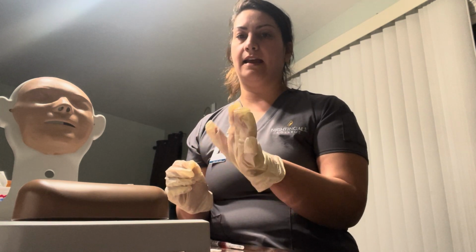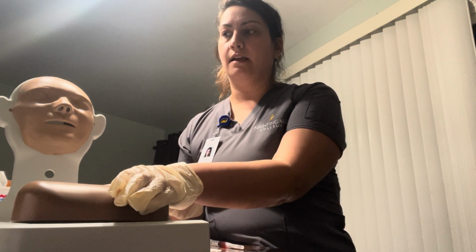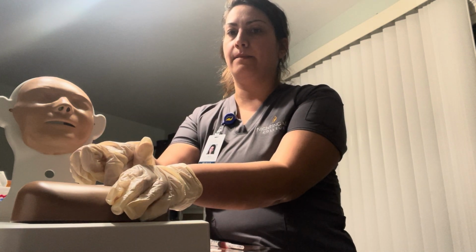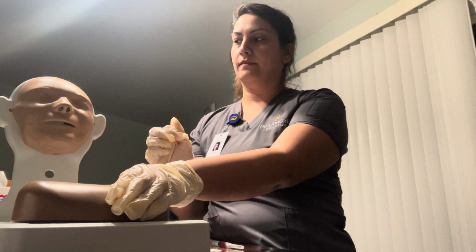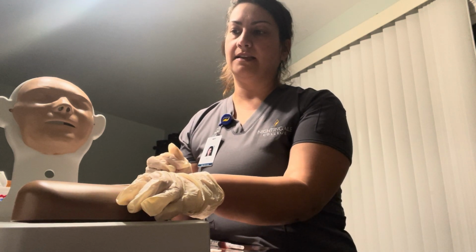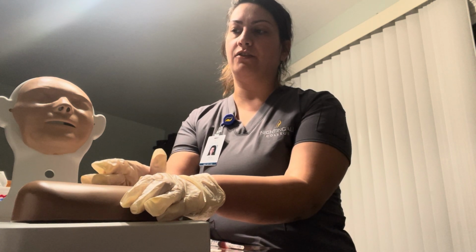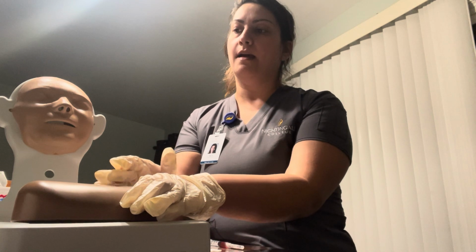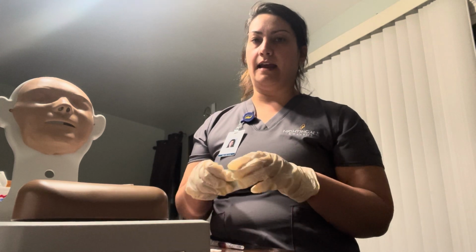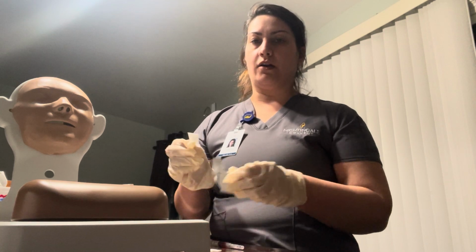I will take my hand, I will place it with my ulnar hand. I will create a V with my fingers out, and this is the area that I will be putting my shot in. I will also inspect to make sure that there's no edema or any discoloration, any redness, any swelling. I would also palpate to make sure that there's no tenderness or swelling. Perfect, there's no tenderness. After I inspect and I find the site, I will go ahead and I will clean the area of the site with my alcohol wipe.